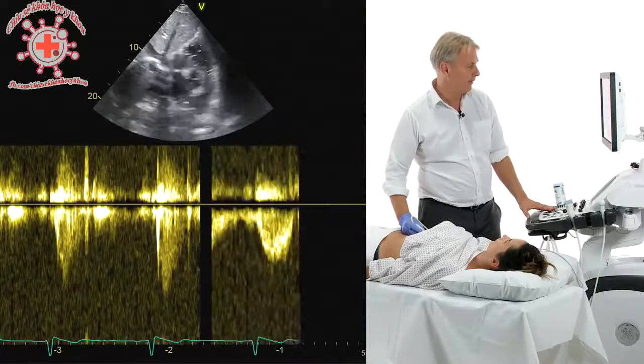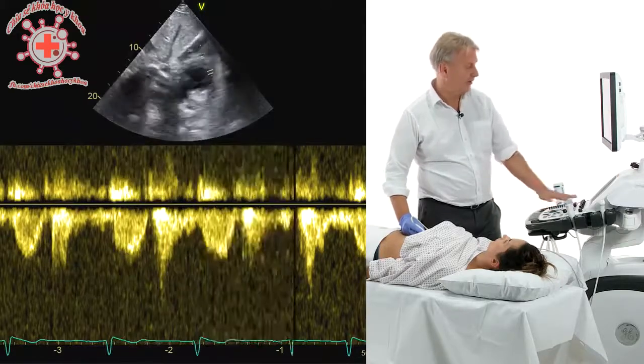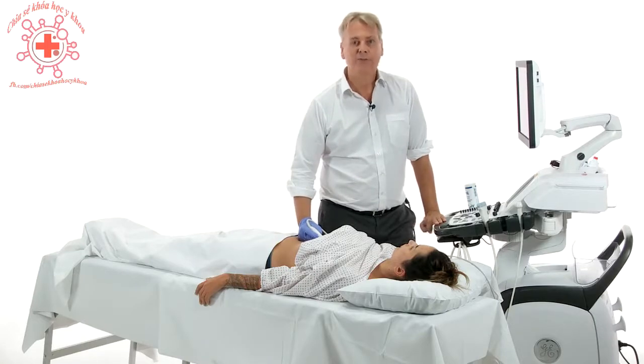You put the transducer right here, and you will often get a fantastic image quality of the pulmonic artery. So be creative when you use the subcostal view, and also use the short axis views to demonstrate the entire heart, just from a subcostal window. So remember, we have to perform a fanning motion perpendicular to the axis of the heart, starting from the base down towards the apex.